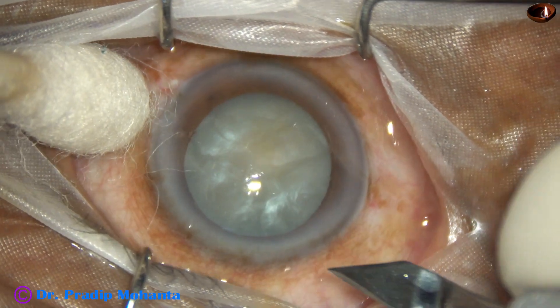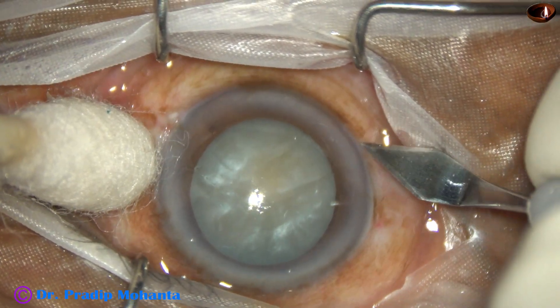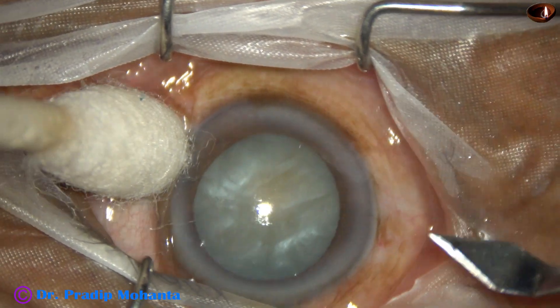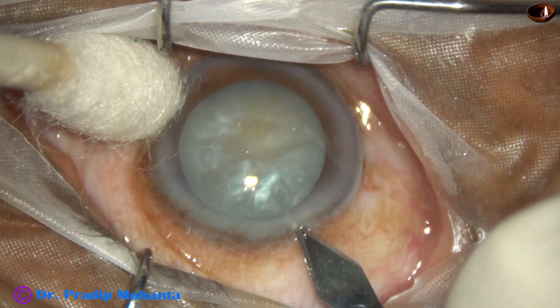After thorough cleaning of the ocular surface, this is a sideport on the right side of the main incision, and this is the main incision.